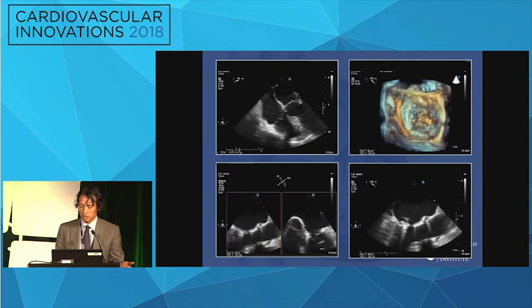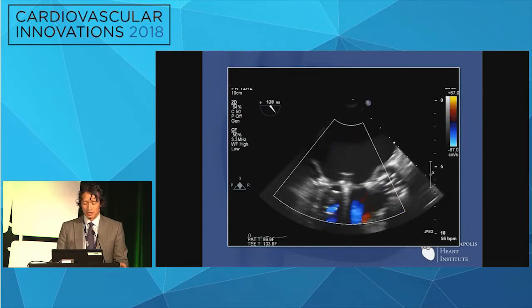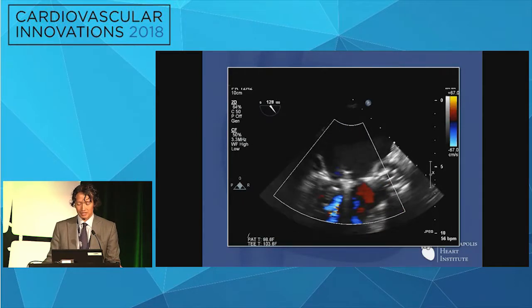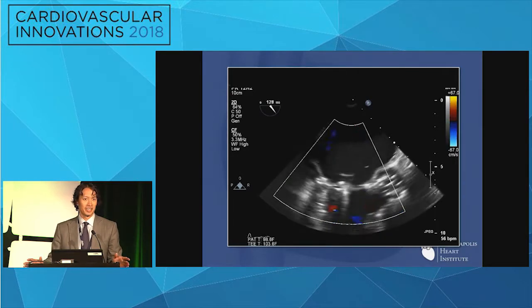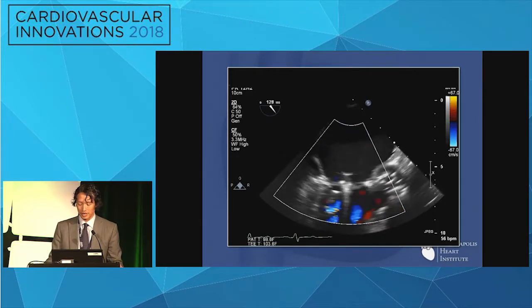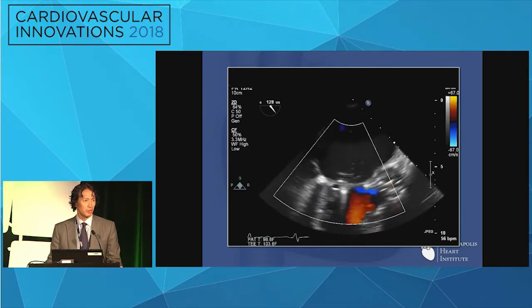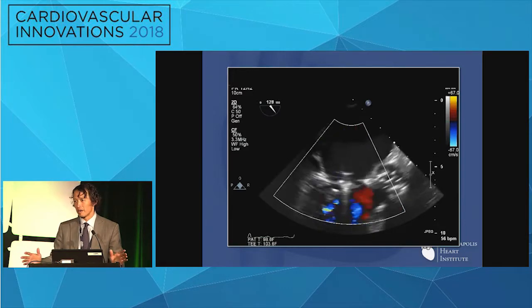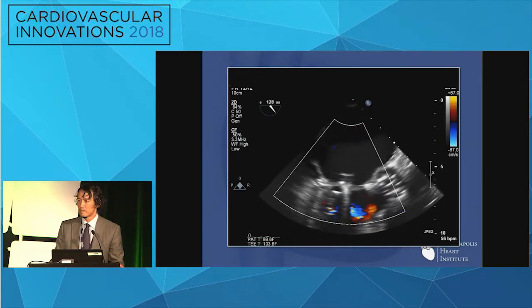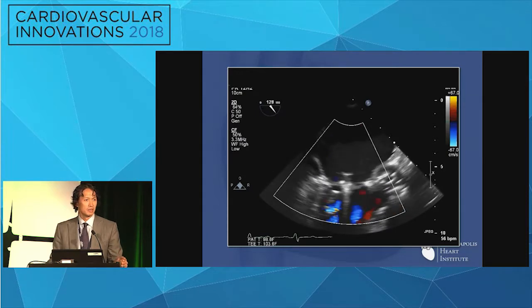The mitral valve is secure. And here's the MR. MR is fantastic. I mean, my surgeon was ecstatic. I don't have to open this patient. Yeah, he's going to do okay. So any thoughts at this point as to what could be wrong or what could happen? I'll give you a clue. It's acute MR.